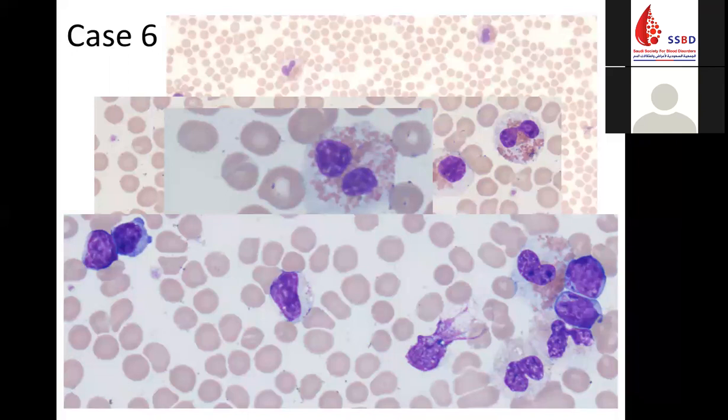This is a case of acute leukemia. We have more than 20% circulating blasts in the peripheral blood. So you would recommend a bone marrow examination, immunophenotyping, and full cytogenetic and molecular study for this patient. Morphology is not enough, as you know, these days.